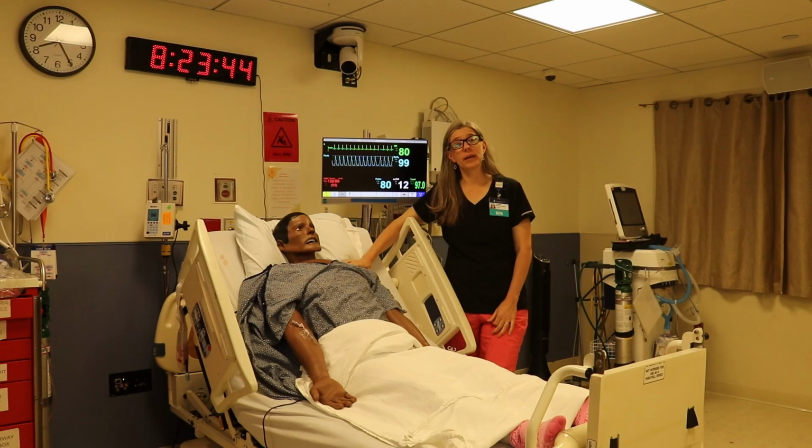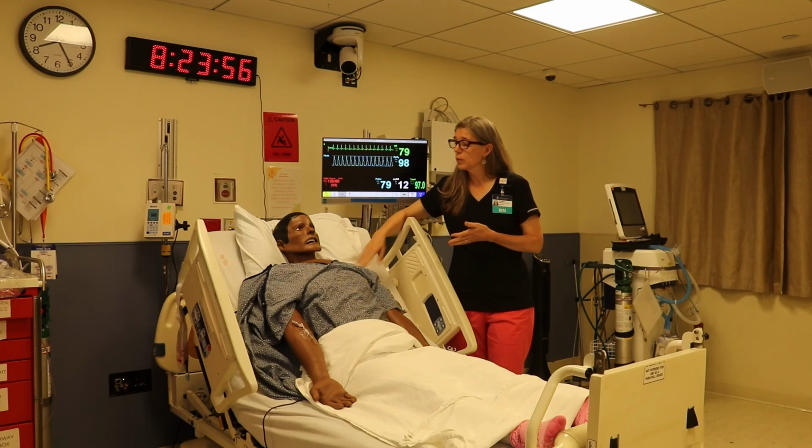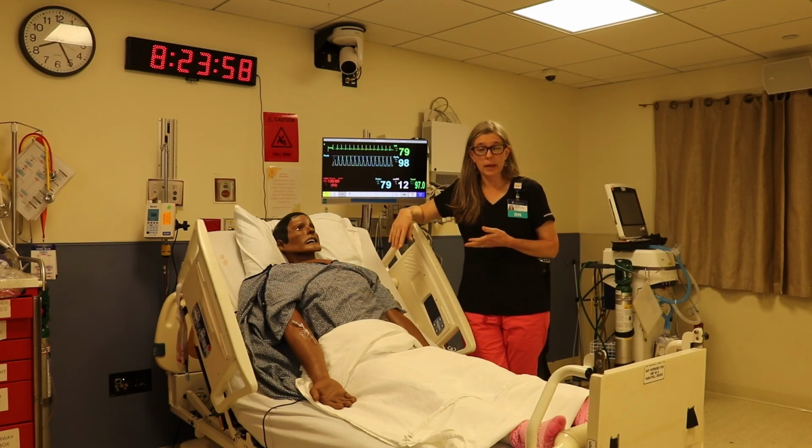Hi, I'm Robin Moralia. I'm the Simulation Skills and Education Specialist in the Sim Center. In this portion of the video, we're going to talk about resources that are available in the ICU for you as the learner to move towards meeting your learning objectives. And we'll start with the capabilities and limitations of our mannequin.